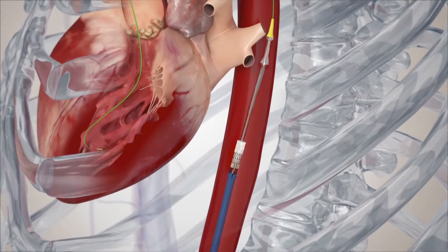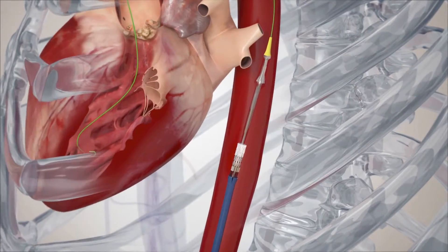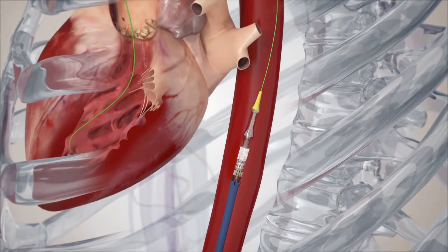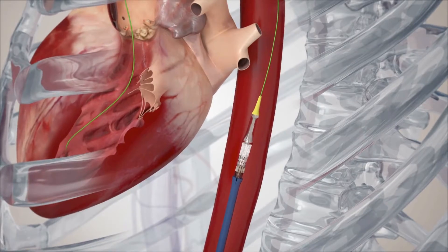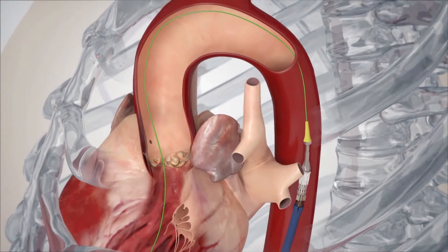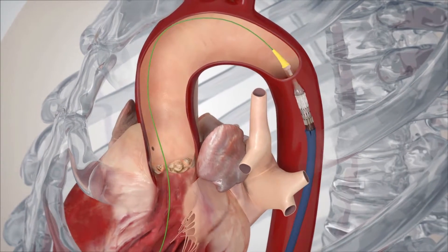Now the balloon is withdrawn back into the centre of the crimped valve, the diameter of the combination increasing slightly. Now that the valve is on the deployment balloon, it is advanced around the aortic arch and across the stenosed aortic valve.